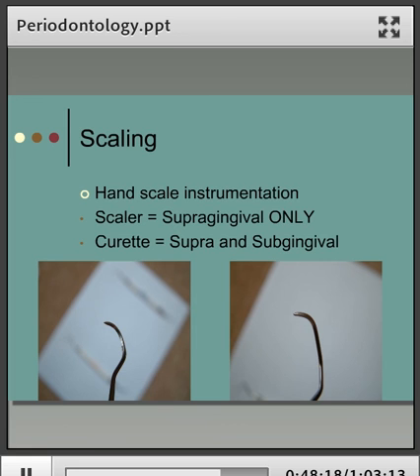But that's difficult. Again, I tend to use your ultrasonic, and the other thing about it is it's not quite as robust as a scaler. So curette's fine, you use it above and below, just be aware it's not quite as robust as the scaler. But generally I'd probably go for something like a sickle scaler that you only use for bulk calculus removal before you start your probe and chart, and your actual scaling is done with the ultrasonic.